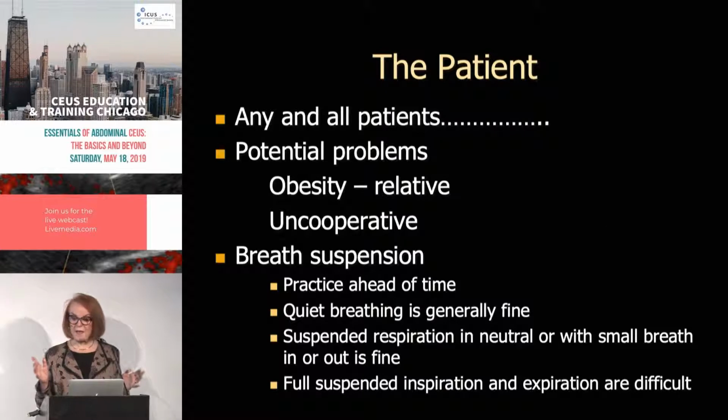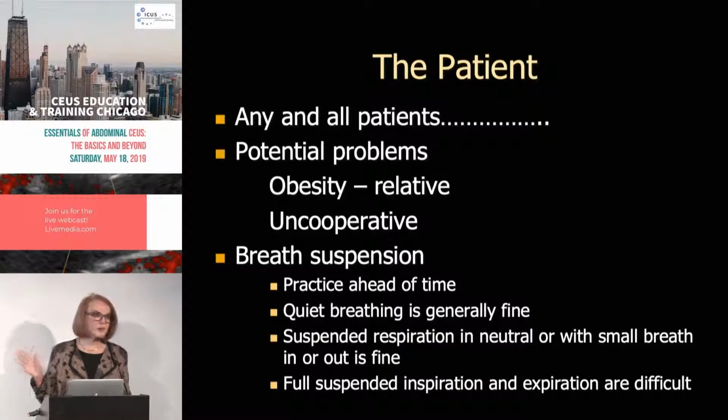And sometimes I have a thing I do with my nurse where I go out of the room and speak to her. It's usually when we're getting more contrast because we've had absolute failure to this point. And I say to her, when I just raise my hand like that, you inject the contrast, but don't say I'm injecting the contrast, because some patients will react. So you've got to practice.